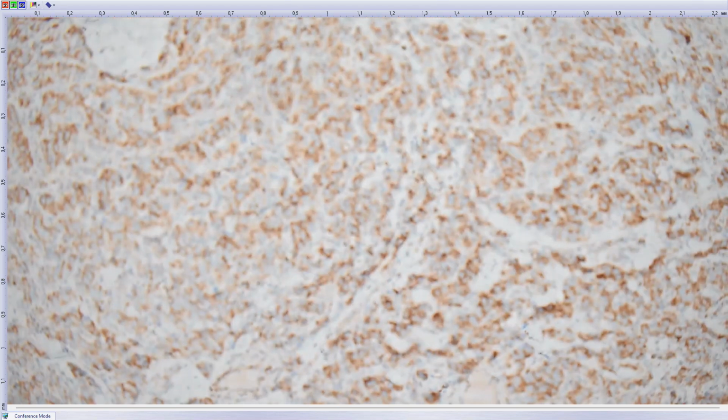It was in the carotid body? Yeah, carotid body, extra-adrenal paraganglioma is the diagnosis. And that's it from my side.